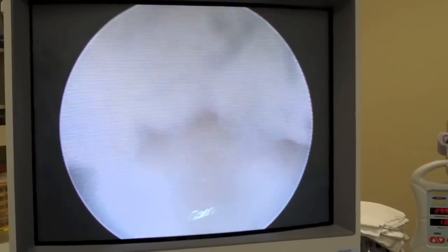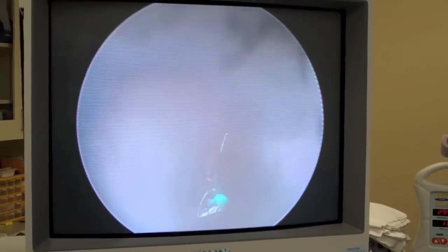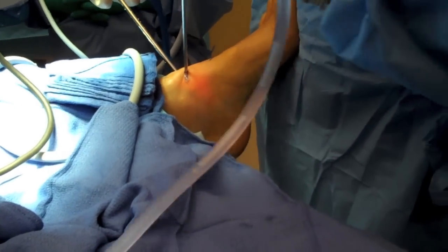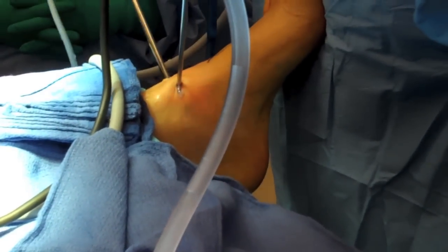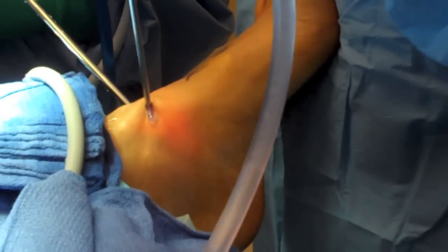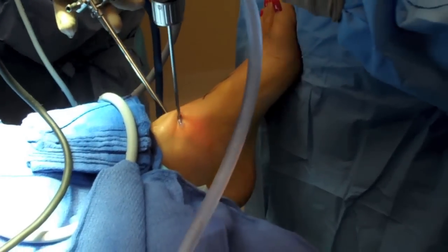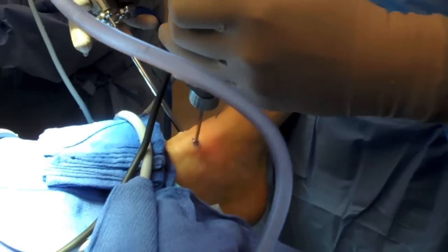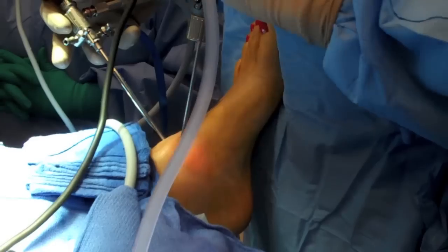You can see the synovitis within this joint being debrided. It is important to be able to utilize both right and left hands when doing arthroscopy. I typically do not use a distractor. The foot is just off the end of the bed. I use my stomach area to dorsiflex the ankle on and off to allow for pouching of the ankle joint to make debridement easier. If I am trying to get into the tibiotalar joint posteriorly, I will plantarflex the ankle to allow the ankle to open up anteriorly.